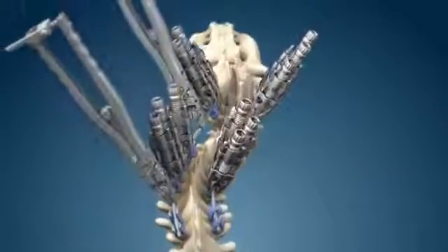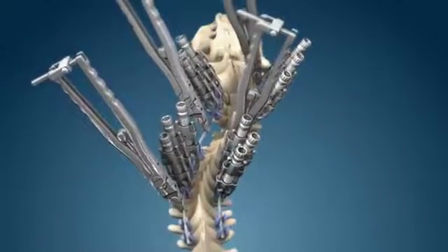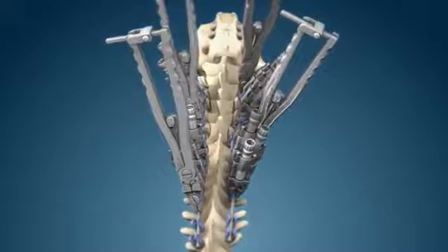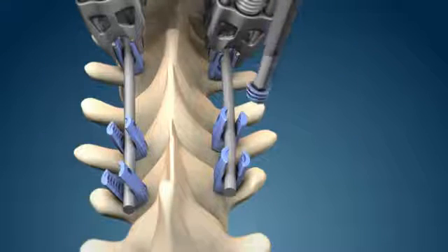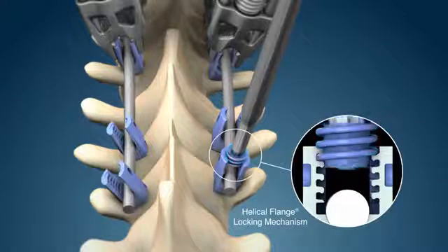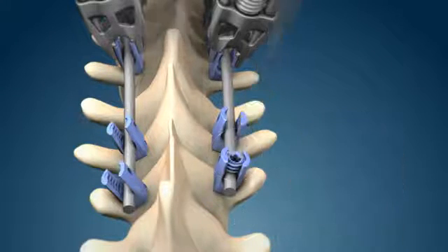Using hex end wrenches or rod grippers, the rods are simultaneously rotated into the desired straight coronal plane orientation. Derotation helical flange plugs are positioned and provisionally tightened to maintain the desired coronal plane orientation.